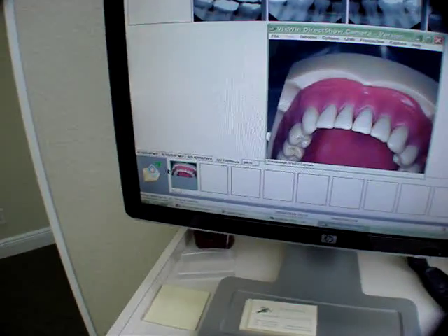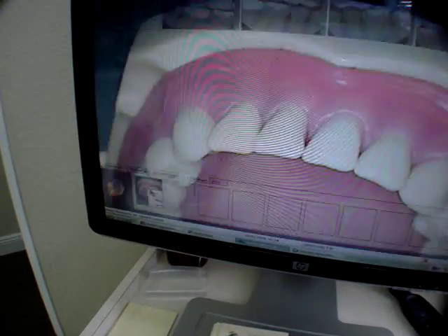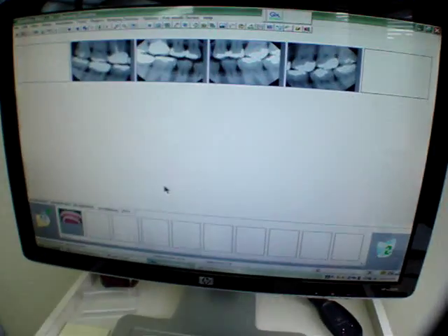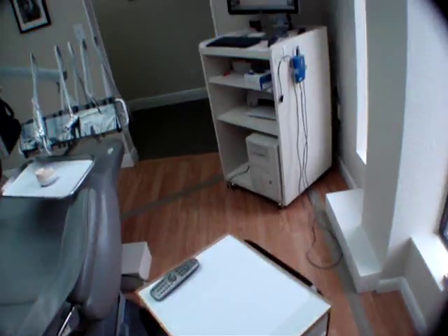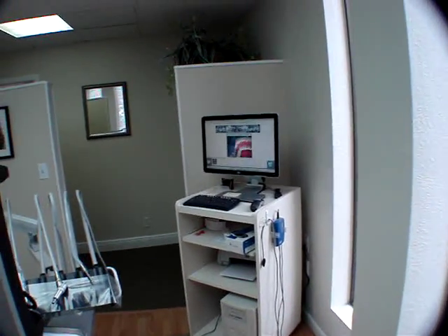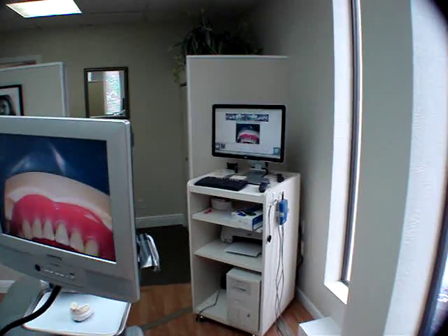You can see it there. If I want to take the mouse and expand that image, I now have the image locked into the computer right in the data file. Bringing the camera back up, we can simply click C for capture again. Now we're live again — you can see both monitors are moving and the image is live.